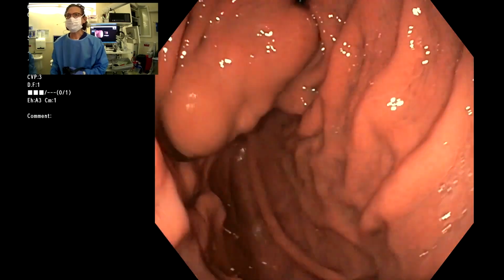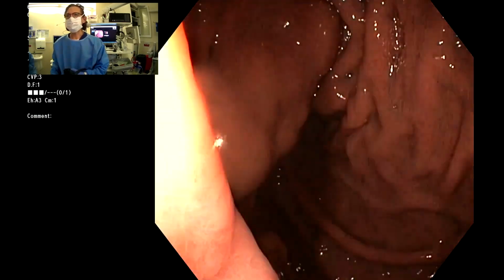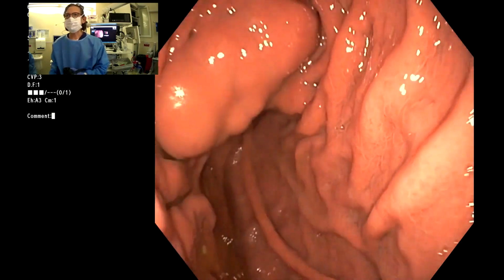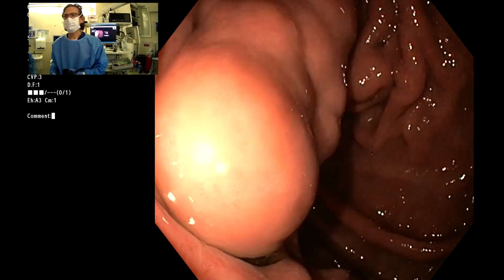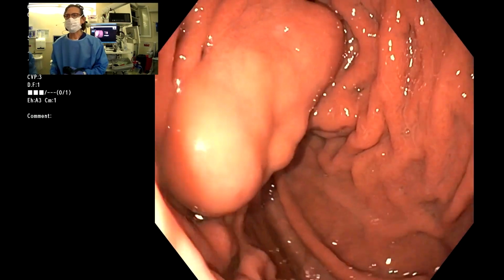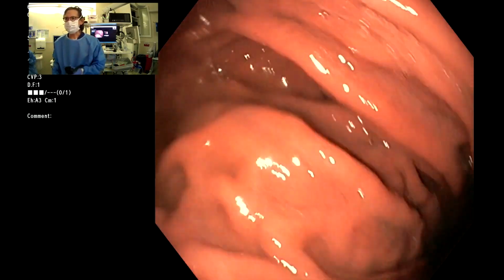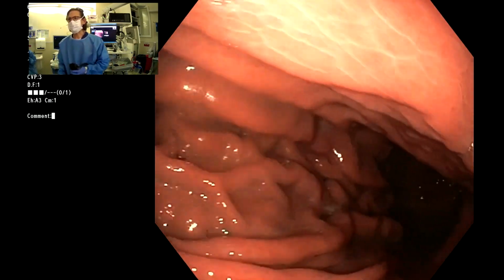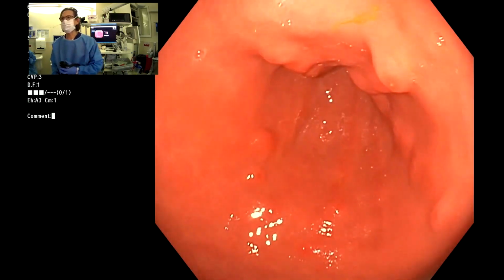And she does have a large fundic varix here. So this is the IGV type 1, isolated gastric varix in the fundus area. Let's take a look quickly to see if there are any other varices in the stomach. Ectopic varices, none seen.